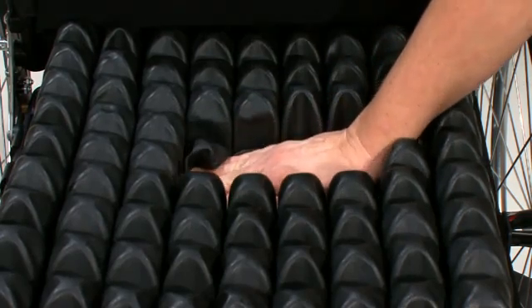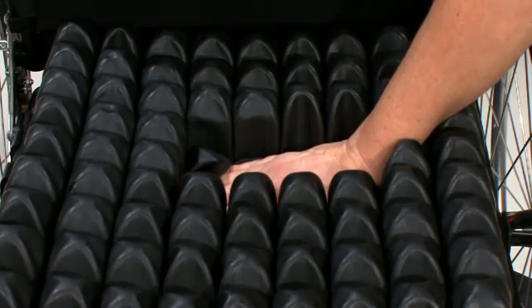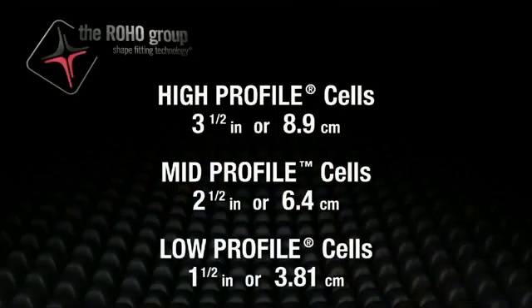Greater immersion into the cushion increases the contact area and redistributes pressure uniformly to maintain blood flow to the areas at risk. So, for example, an individual using a properly inflated cushion with high-profile cells will be immersed into the cushion 3 1/2 inches, 8.9 centimeters, versus an individual using a properly inflated cushion with low-profile cells will be immersed 1 1/2 inches, 3.81 centimeters.